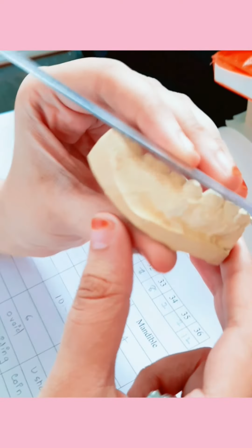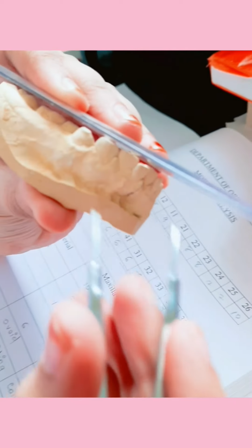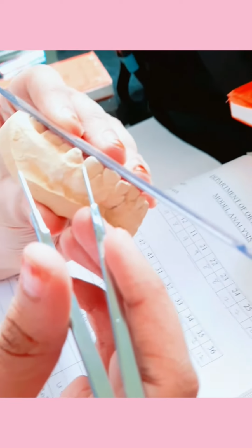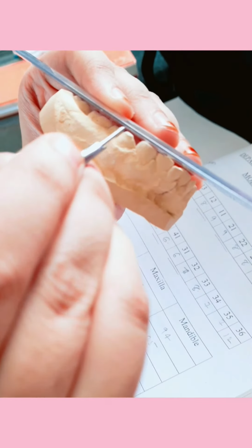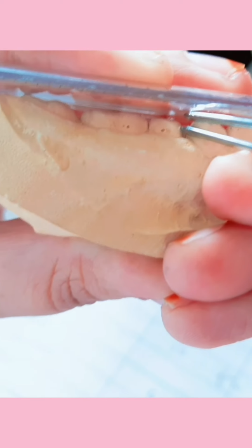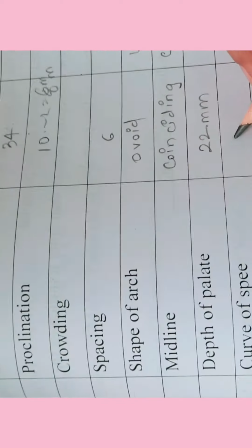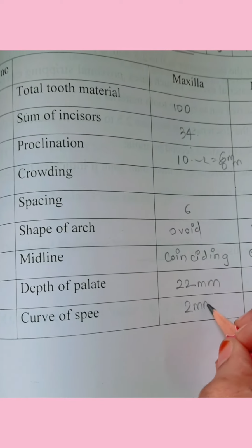Now we measure the curve of spee. Again, we place it from the tip of the canine till the molars, and we take the divider, keep it in the interdental area between two premolars. Okay, from the scale till the interdental area and measure it. So it is very small here. It's around 2 mm between two premolars. So yeah, it is 2 mm.